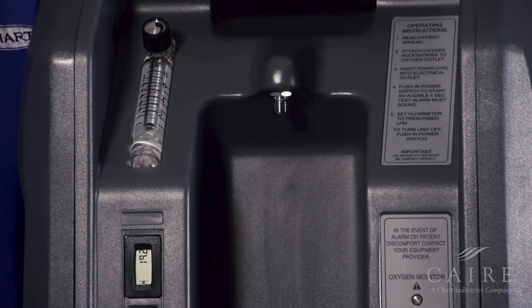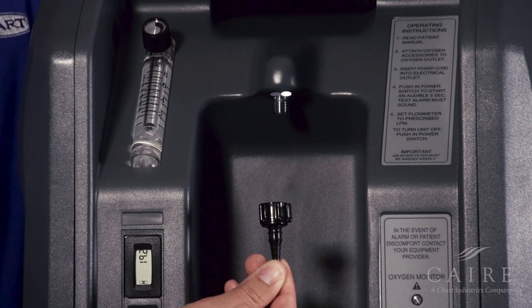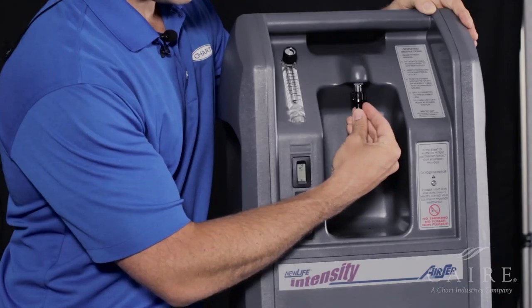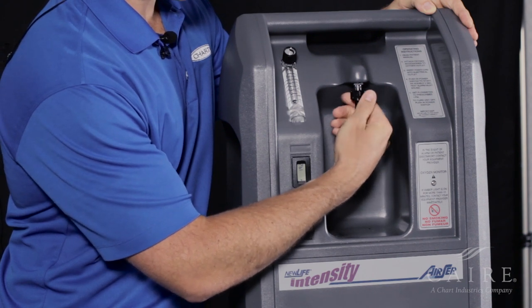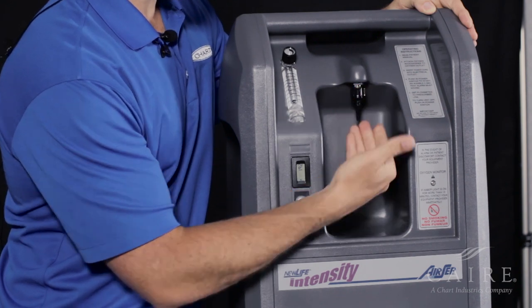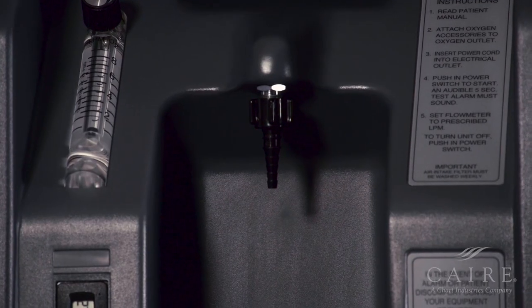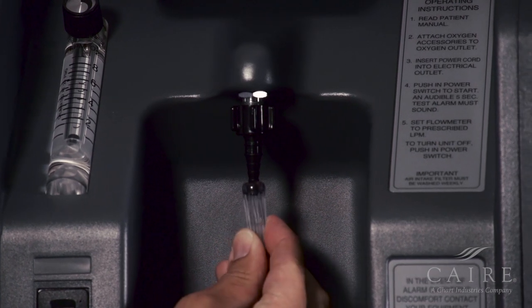Now we're going to attach two different options. One option is our disc Christmas tree adapter for straight cannula. Simply line up and then thread it onto the actual unit, like so. Once firmly secure, you'll notice that it looks like an upside-down Christmas tree. Simply take your cannula, female end, and insert it to the male end, like so.